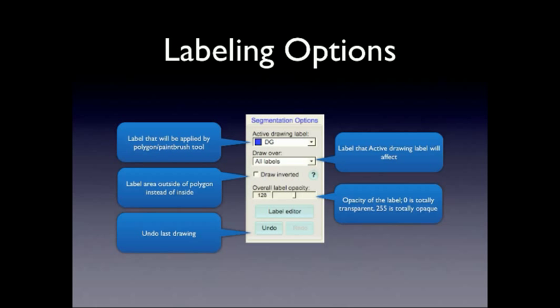So active drawing label is the segmentation label that you're going to apply. And draw over is what labels you can apply that to. So this might be a little confusing, but I'll show you all this in the demo and it should be clear. But this is an important thing to get. So the idea here is that you may not want to apply this label to everything. So right now, draw over all labels means wherever you put your paintbrush, it's going to draw that new label. But you can have this draw over only a particular label, only a clear label.